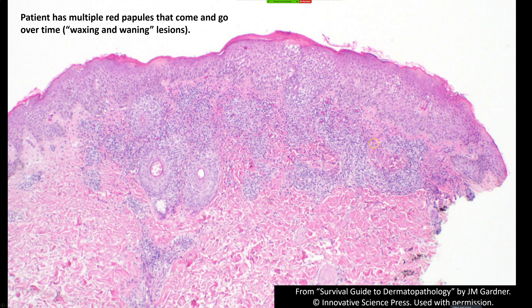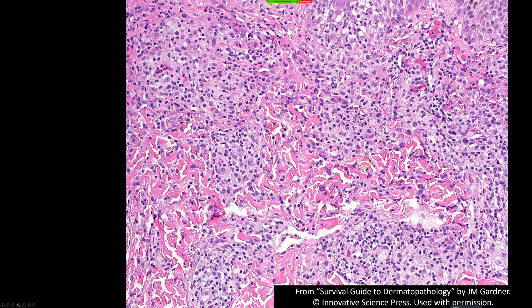Microscopically, what we see is an infiltrate — there's a little spongiosis with this one — but basically an infiltrate that's in the superficial dermis and kind of goes away as you get deeper. If you have a good imagination, you could picture it as wedge-shaped or upside-down triangle-shaped, but basically it's top-heavy: an infiltrate at the top of the dermis and not as much in the deep dermis.